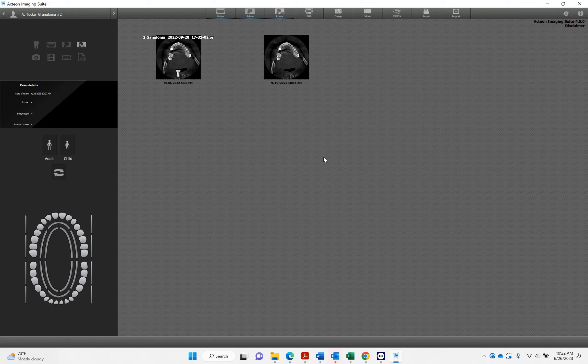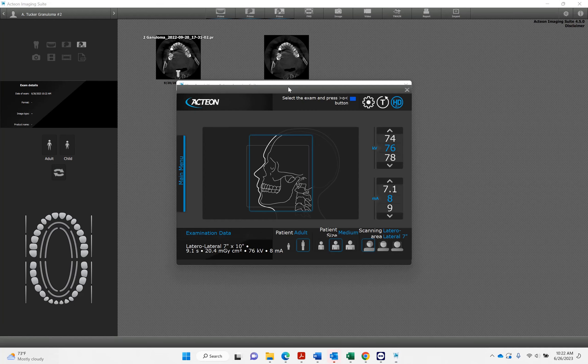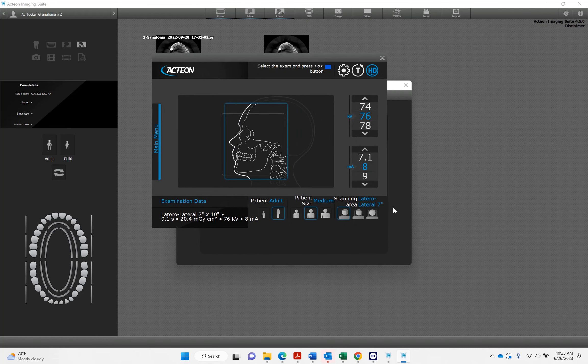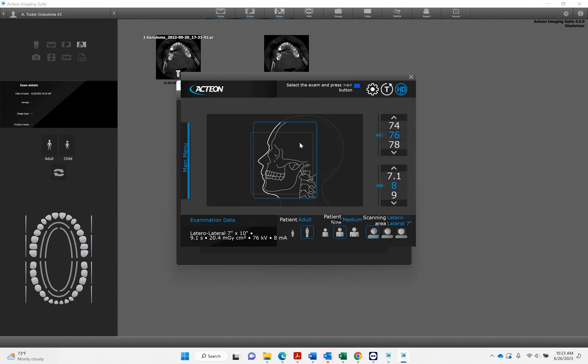When you're taking a CEPH, you're going to acquire this through your existing software. This box is going to pop up. I'm taking this locally in the Action imaging suite, but traditionally you'll take this from whatever imaging software you have. It says select the exam.